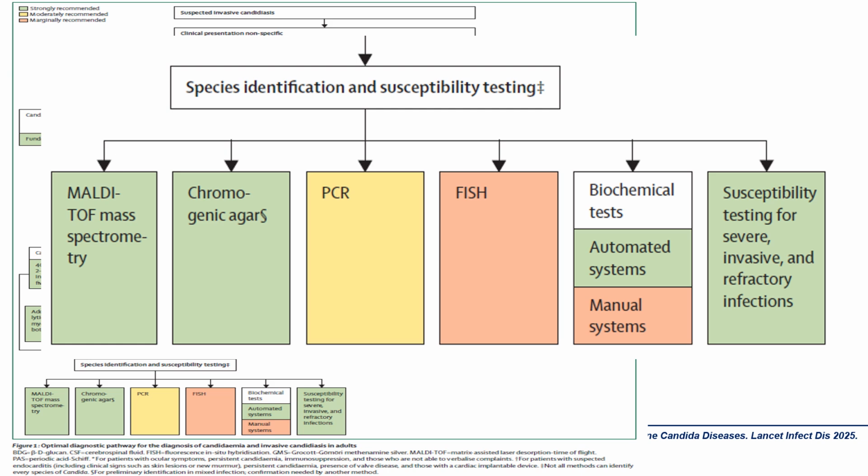So finally, I would like to conclude that molecular identification of culture isolates by MALDI-TOF is strongly recommended to provide species level identification. Sequencing from culture isolates is strongly recommended, particularly in specialized laboratories, when identification could not be obtained by biochemical methods, or when the species is new and is not available in the database of MALDI-TOF.